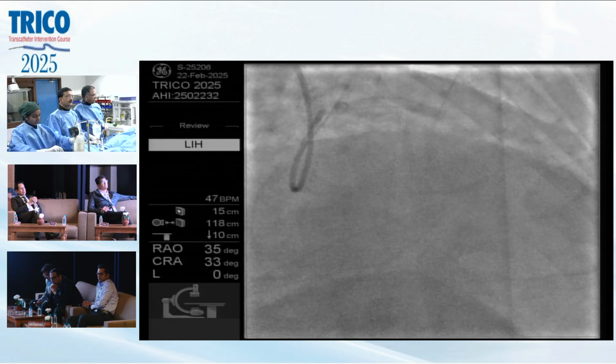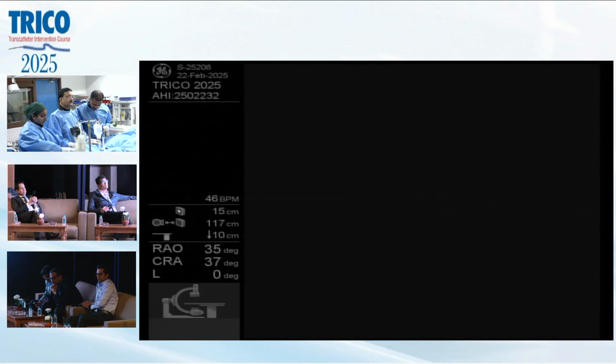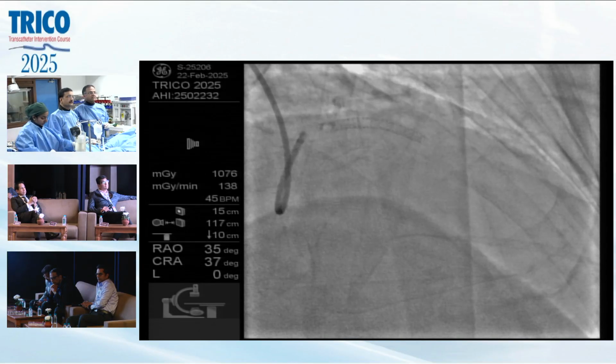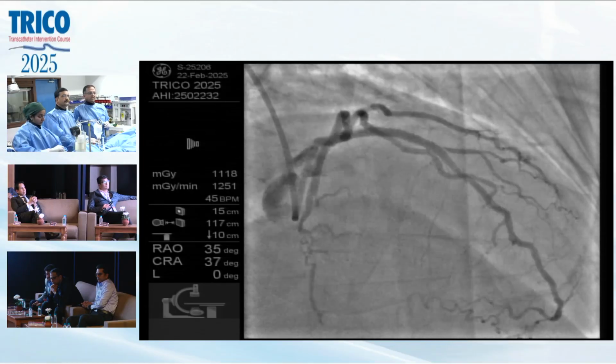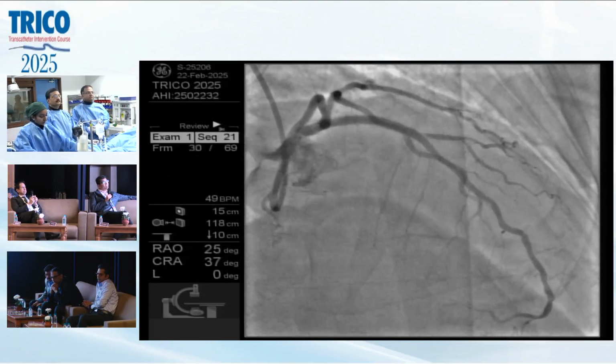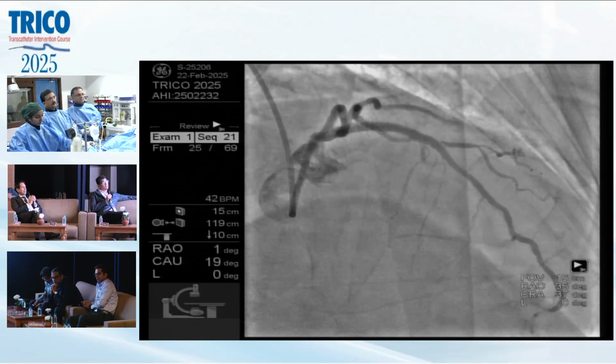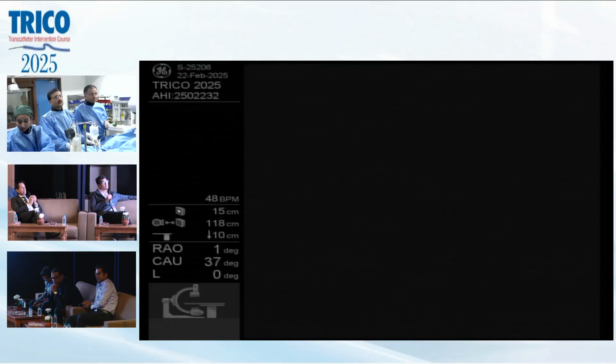That's good. Yeah, looks nice. Beautiful. I think everyone in the audience is very happy here. That's a great result. The flow is better in the LAD.